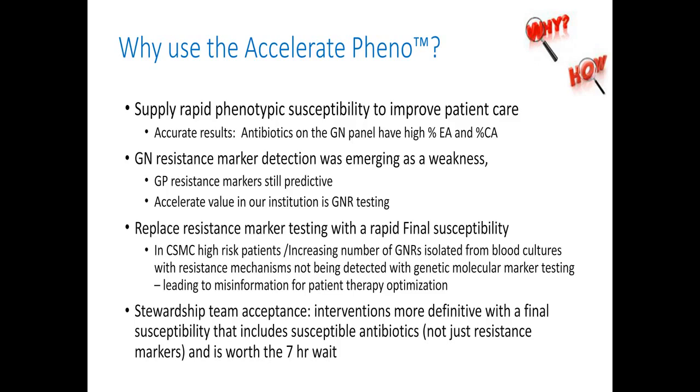Well, the monomicrobial call is cited under the notes on the report that you get after the completion of the Accelerate run. It is actually on the report that you observe on the computer or when you print out the results. The monomicrobial call gives you information that that positive blood culture that you just ran on the system is positive for only one pathogen.